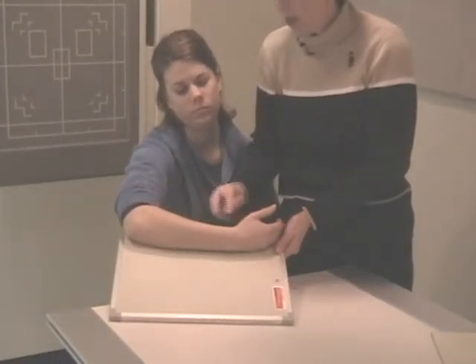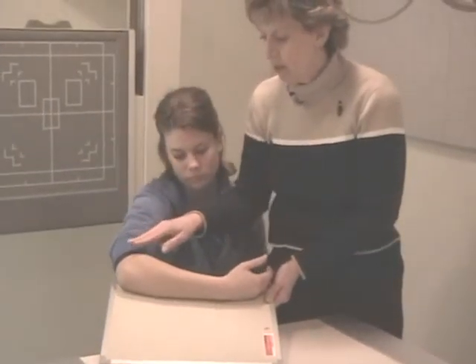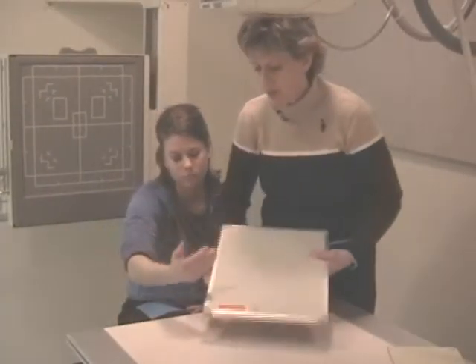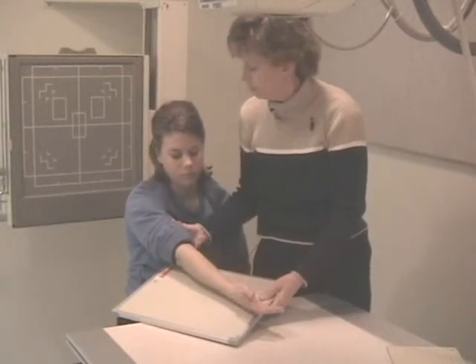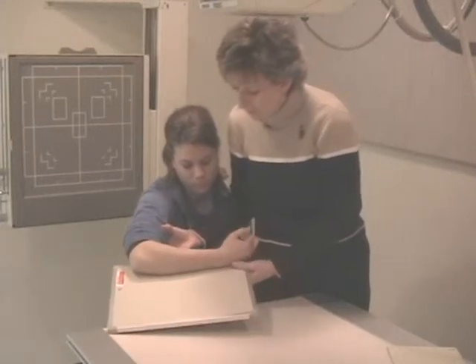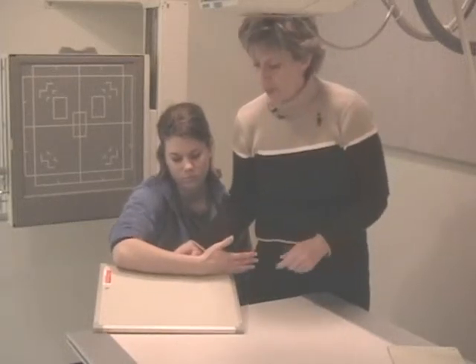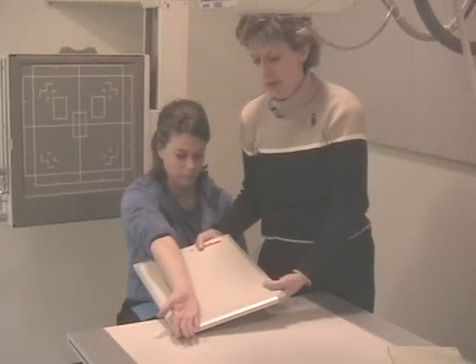Just always think about, in a lateral position, the forearm and the elbow will be bent, and you want the humerus coming off this edge of the film. For a proximal, it would be the same thing, other than the ID blocker is, I'm sorry, I said proximal, didn't I? Distal, the lateral would be on this side, the ID blocker would be towards the elbow, and then the AP would be on this side. Okay?